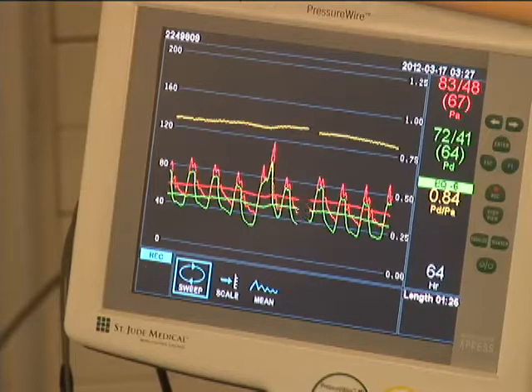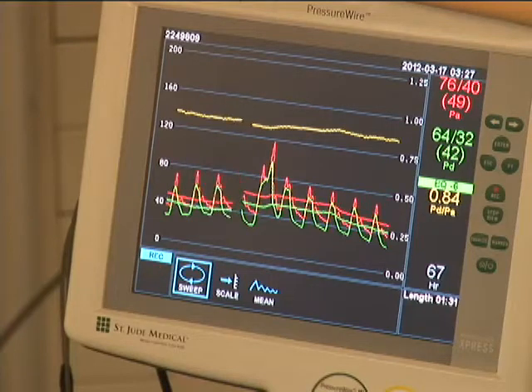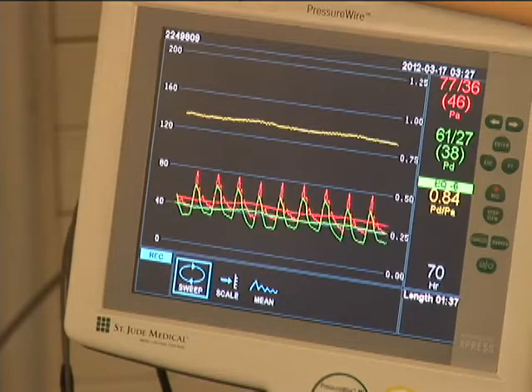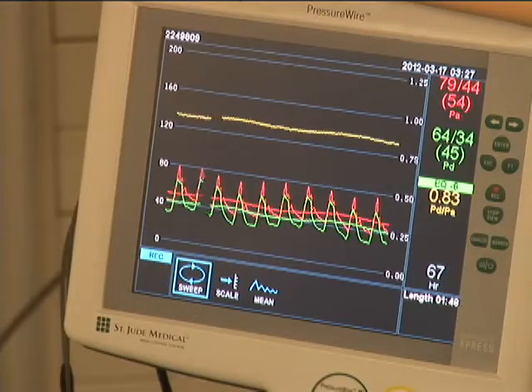Alternatively, intracoronary injection of adenosine may be administered in escalating doses. However, it is felt that continuous IV infusion of adenosine is more reliable as it provides a more consistent pharmacologic and physiologic steady state. During adenosine infusion, the hemodynamic tracings and FFR can be monitored in a live fashion.